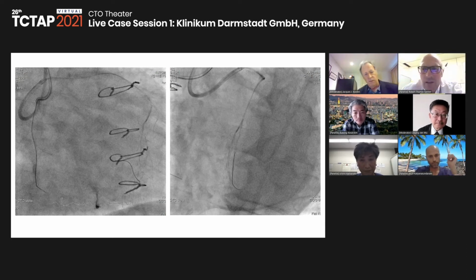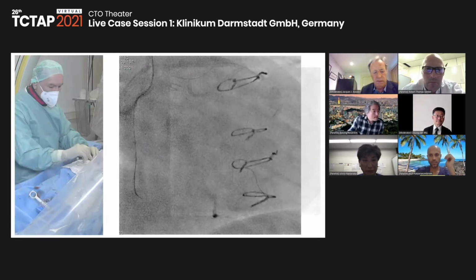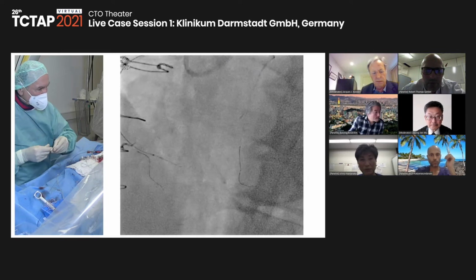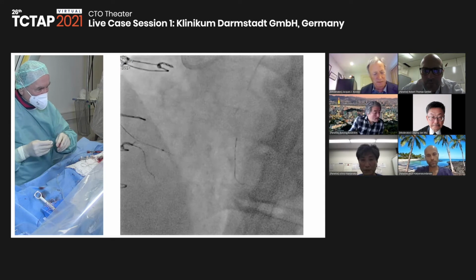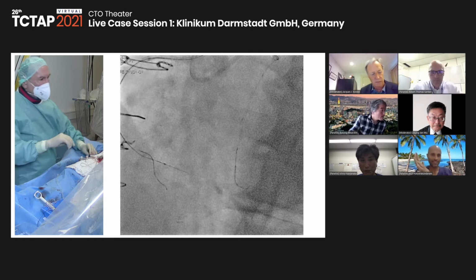You know, I have to say, I did like that big first septal you pointed out right at the beginning. Okay, it was quite a tight angulation with the stenosis at the beginning, but I think once that's negotiated, it looked like that was quite straightforward. Yeah, obviously, I will switch to the first one again. While I again push my wire, it's unbelievable. But fortunately, the Fine Cross is stuck so tight that I couldn't take it out again. There is the tendency today for me to work on this antegrade thing. So let's get the wire back.